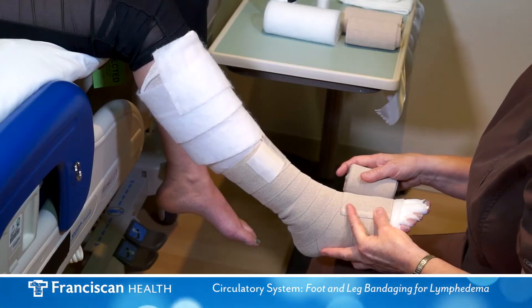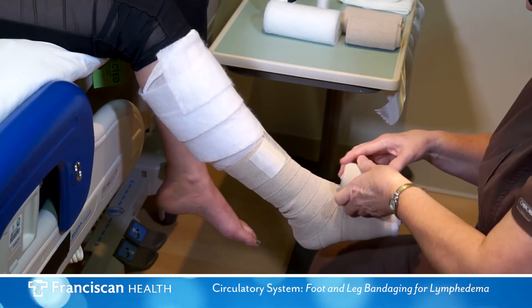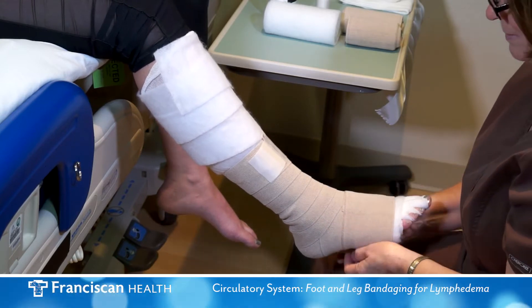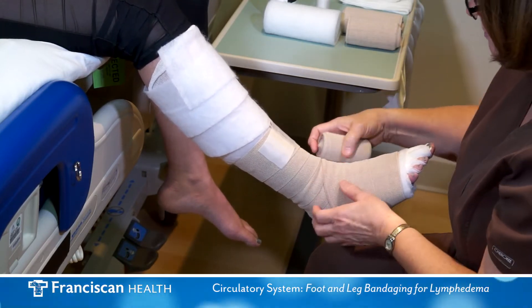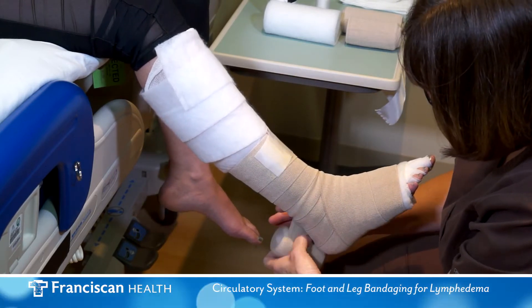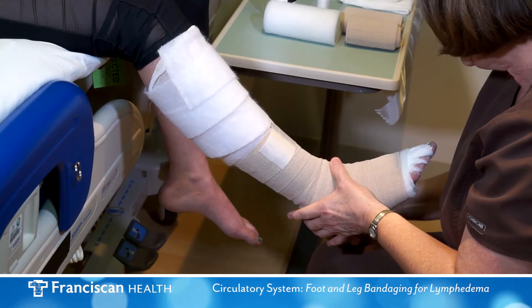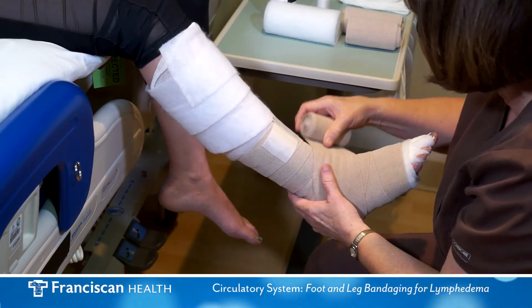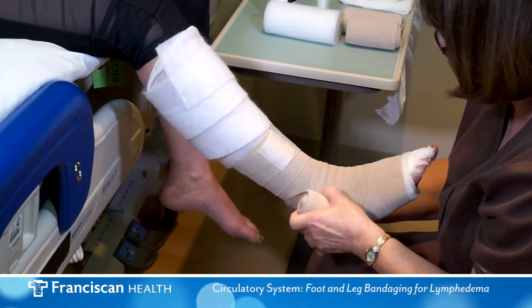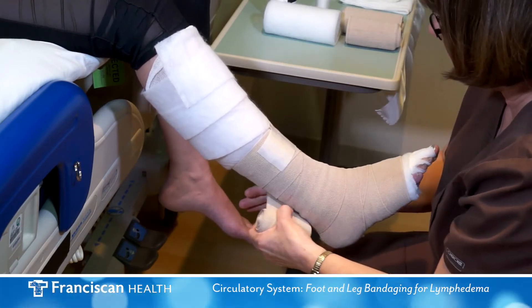The second compression bandage is the next largest. Start at the base of the toes, wrapping in the opposite direction of the first bandage. It is important to alternate the direction of the wrap for each bandage to maintain the appropriate pressure. Spiral wrap up and over the foot, heel, ankle, and up the leg, maintaining moderate pressure on the bandage.